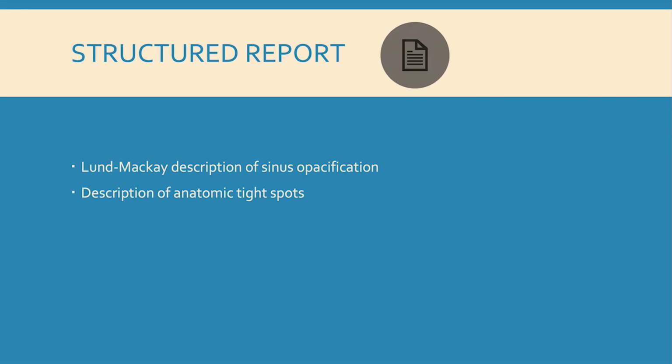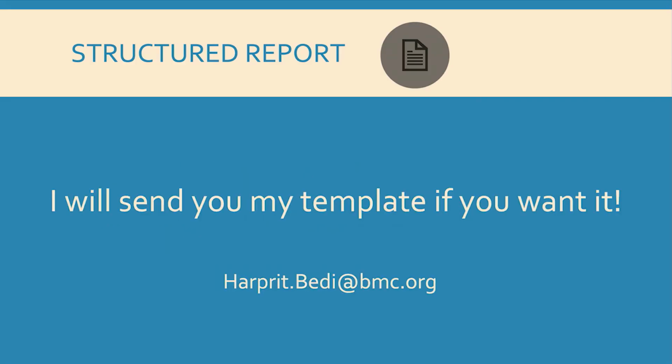Structured reporting can really talk about all this stuff. And by the way, I will give you my report. Take down my email. I will send you my template and edit it to your heart's content. If you're like, oh, that's way too much, I'm not saying that, just delete the parts that you don't want to dictate. I can send you my PowerScribe report, make life easy for you, okay?